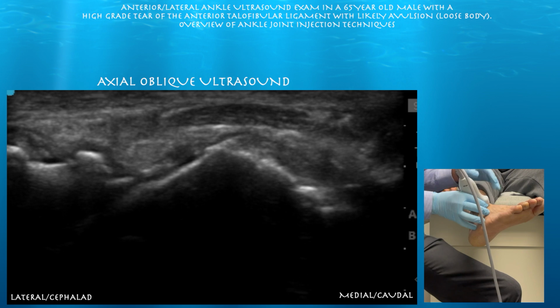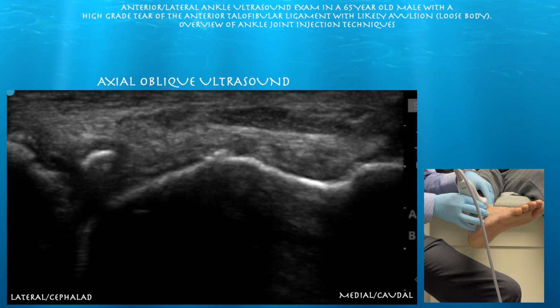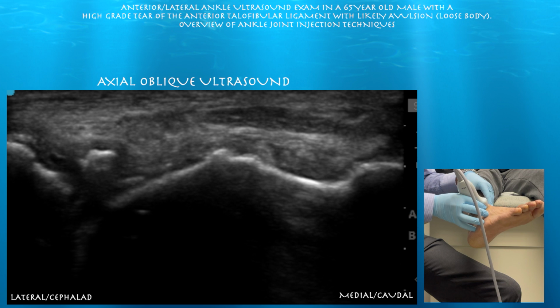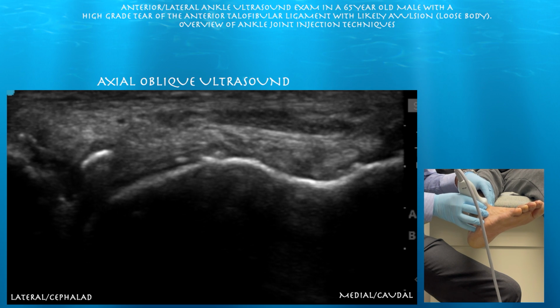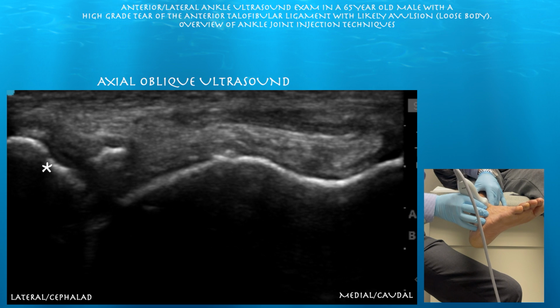Here's our first clip. We can see that calcific body. It looks like it's really in the region of the ATFL. So here we don't really see any continuous fibers of the ATFL, consistent with just about a complete tear of the ATFL. And this patient did admit that he twisted his ankle about a month prior to presentation. So this could be a subacute type of injury with avulsion, perhaps of the distal fibula from the ATFL.